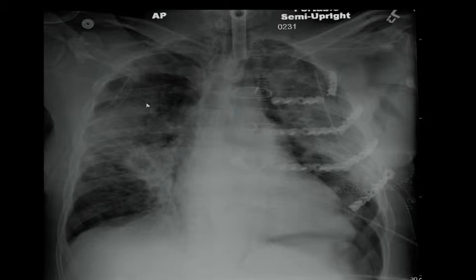Could be, but I'm trying to focus more only on this, and while you're right, it's going very intimately in contact along the left mediastinal border. It could have been that, but this is what my finding was. So anybody who wants me to explain deep sulcus sign, anyone who could not identify this, because if you were not going to identify this in the exam, you are definitely coming back next year, right? So we cannot not identify this.